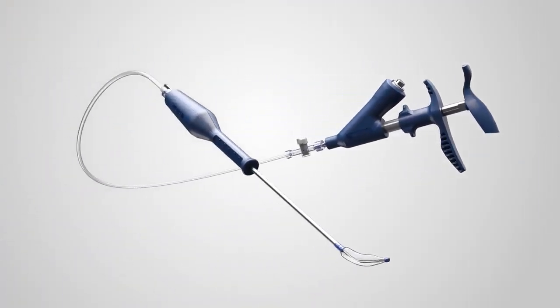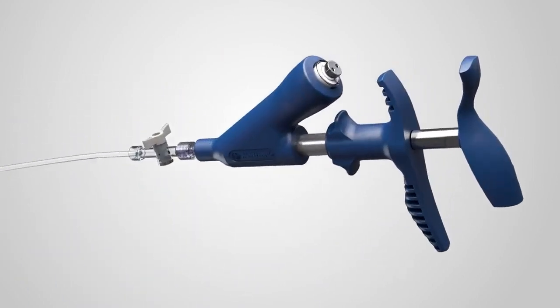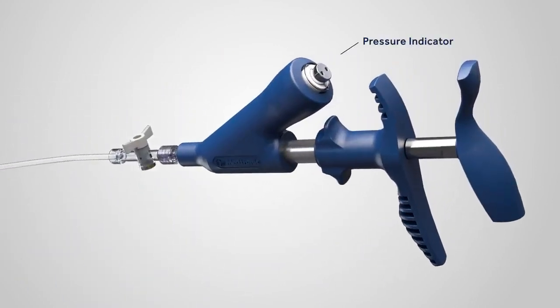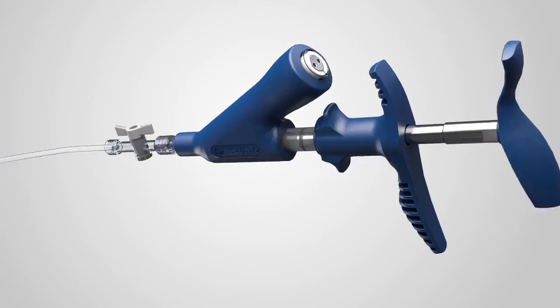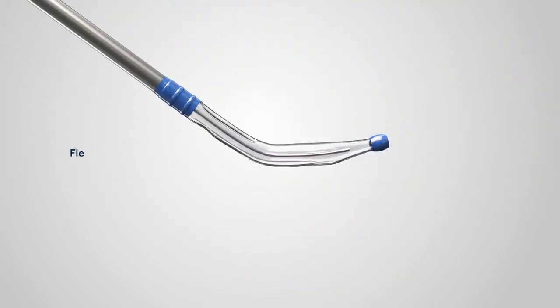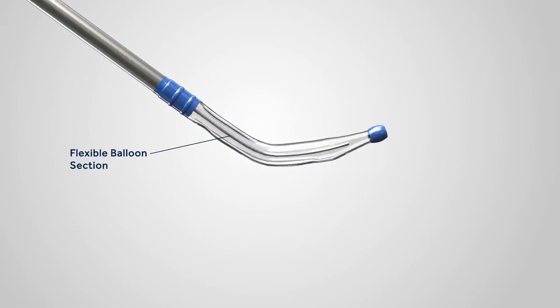The NuVent eustachian tube balloon includes an inflator, extension tube, and the balloon device with stopcock valve. Attach one end of the stopcock valve to the inflator and the other end to the extension tube. The system includes a pressure indicator as a safety feature, allowing proper pressure to inflate the balloon. The stopcock valve is activated after the balloon has been inflated, mitigating the need to manually hold pressure on the inflator for two minutes.